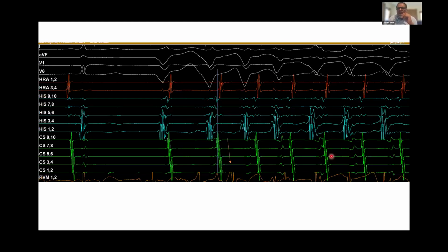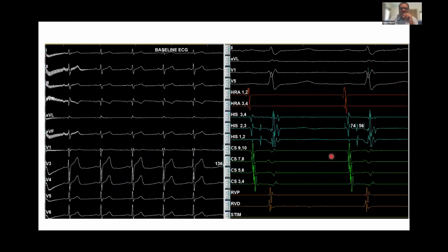It is important to identify whether retrograde conduction is happening, which is going to be important to decide whether, in a concealed accessory pathway, the retrograde conduction is happening from an accessory pathway. So when we do an EP study, we look at the 12-lead ECG.